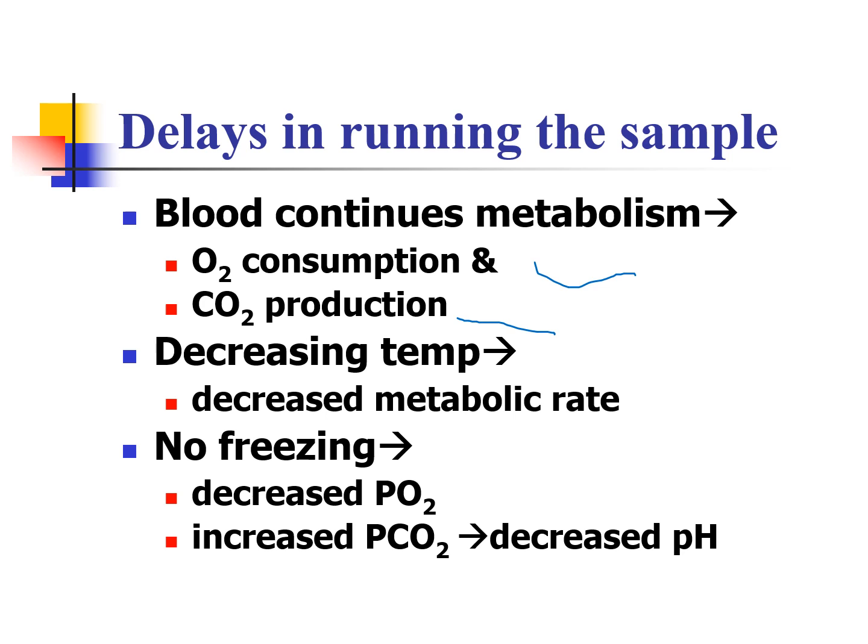But do not freeze it, right? It's not there for frozen. If you freeze it, that will actually decrease PO2 and increase CO2, and the pH will look more acidotic. This is a whole bad situation. So you want to cool it so it doesn't continue to metabolize, but you don't want to freeze it.